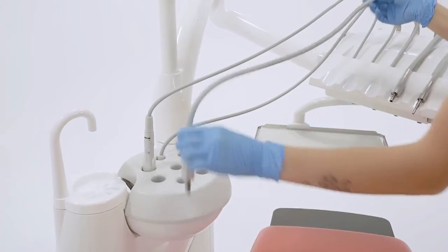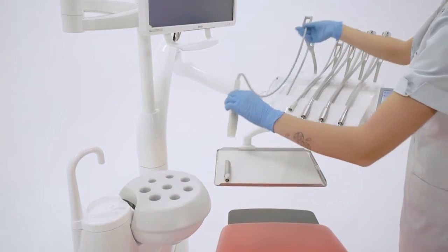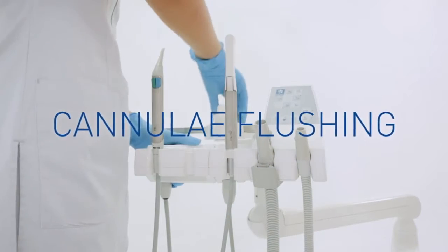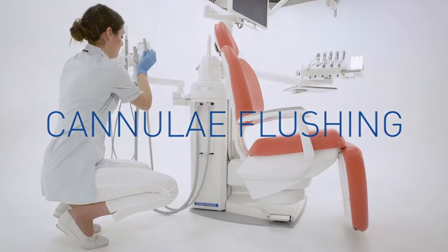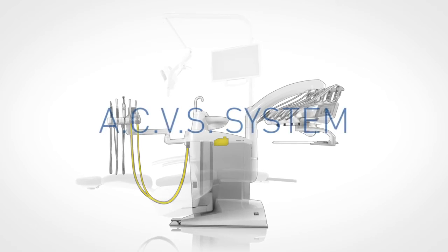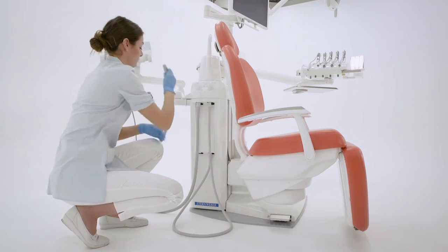The assistant takes the instruments from the tub and arranges them back in the dentist's module. To activate cannulae flushing, the assistant connects the suction hoses to their special coupling points on the unit body. The ACVS system is automatically activated after the insertion of the second suction hose.